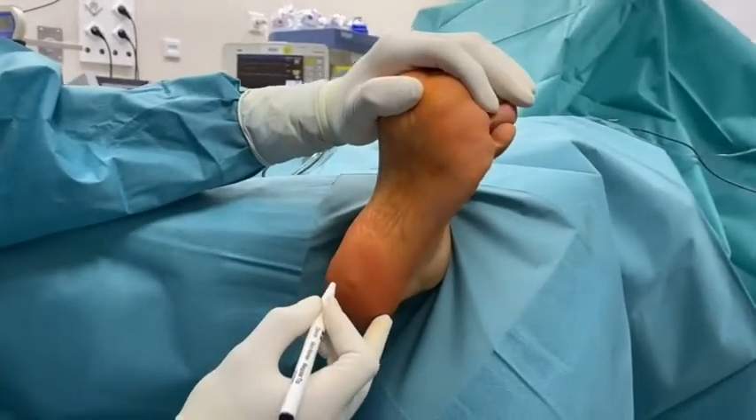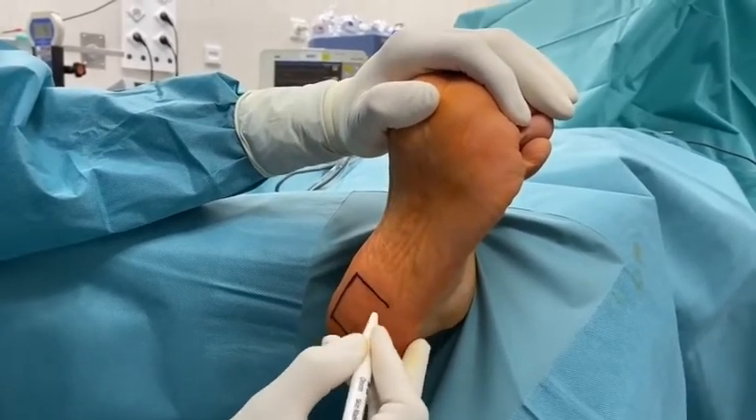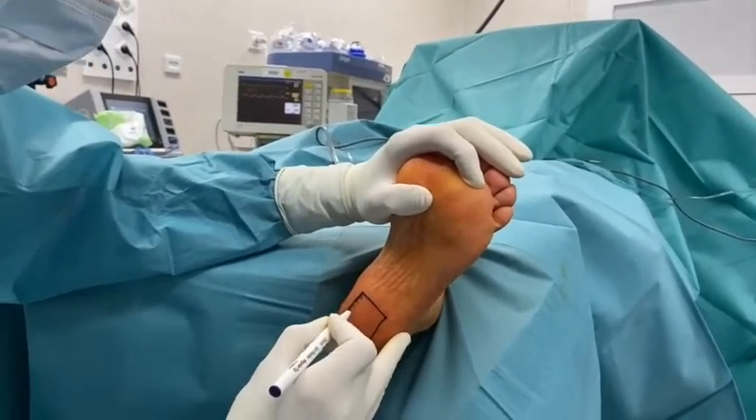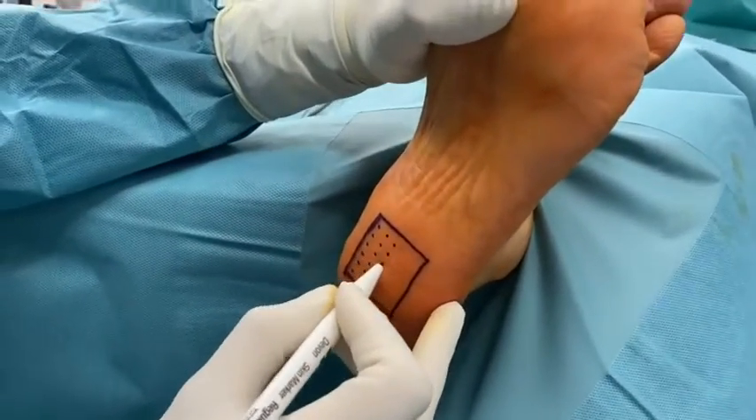With the ankle in dorsiflexion, the painful heel area is tested and drawn on with a sterile marker. Points where radiofrequency will be applied are also drawn inside the painful area, with a distance of 5 mm in between them.